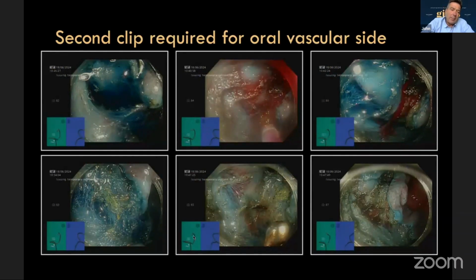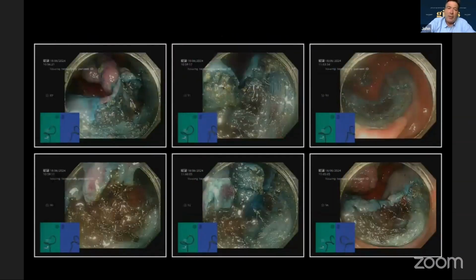But the stability here was terrible. You know, you haven't really got one-to-one control. Controlling the tip is difficult, and at the same time you've got the lungs going up and down. So every time you make a cut, they breathe, you wait, you make a cut, they breathe, you wait, you make a cut, they breathe, you wait. Not easy.